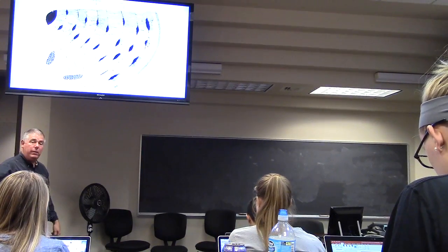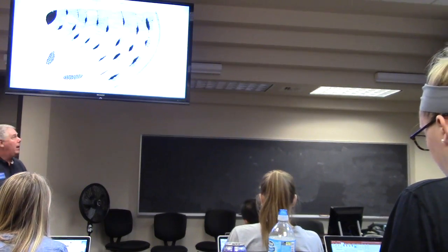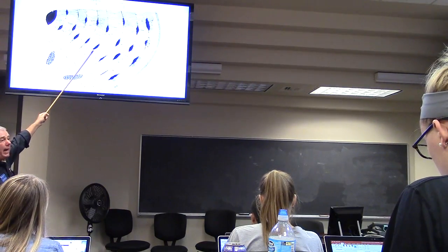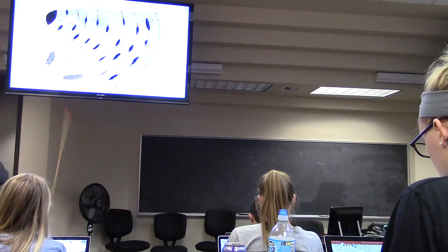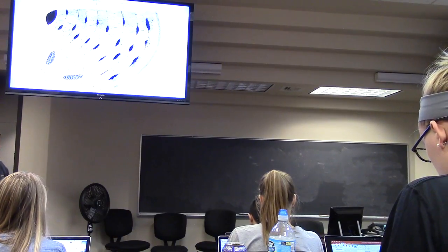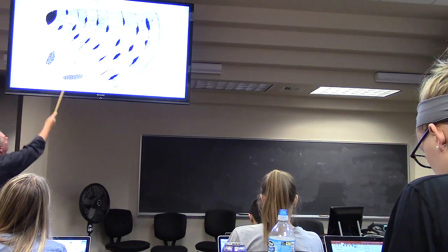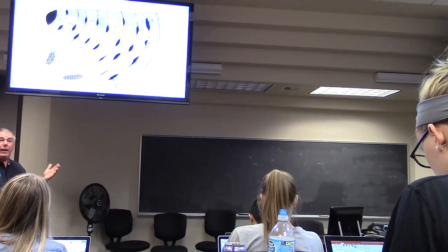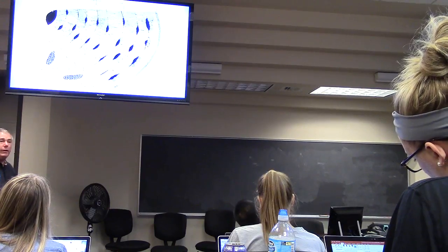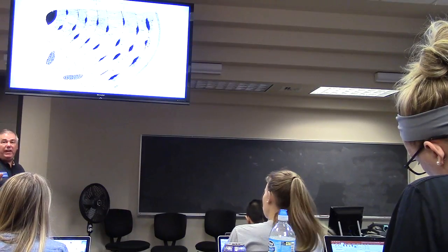So remember, though, the bone doesn't diffuse. They're connected by canaliculi. And that's what you see here. All these little osteocytes are connected by canaliculi to the Haversian canal, which is where the exchange with these fenestrated capillaries occurs. So you've got all of this. I mean, a bone can only get so big because you've got to be able to move nutrients all the way through these canaliculi to reach the end. The compact bone can only get so thick.